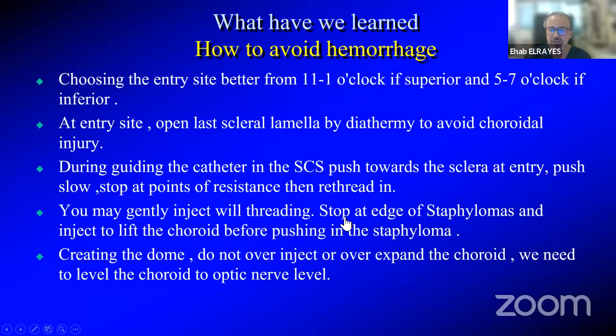How to avoid hemorrhage? It goes step by step. I like to use first between 11 and 1 o'clock if I'm using superiorly, or start at 5 to 7 if I'm using an inferior location for entry.